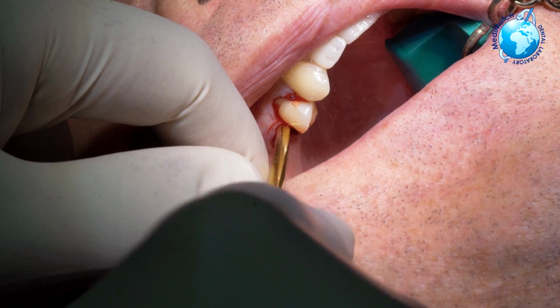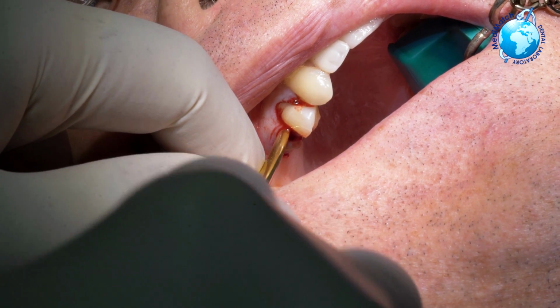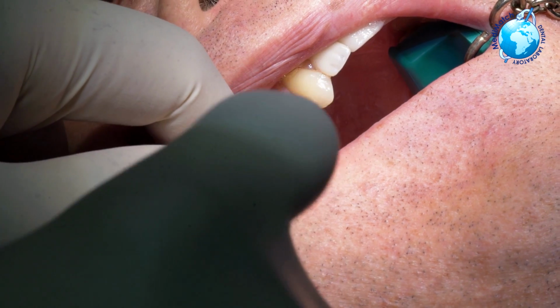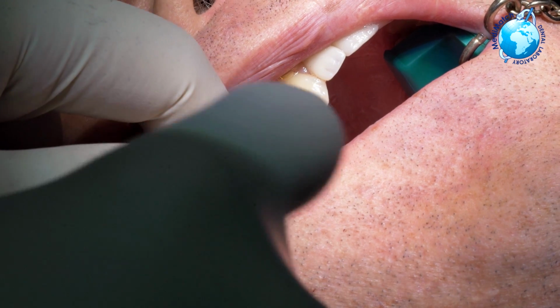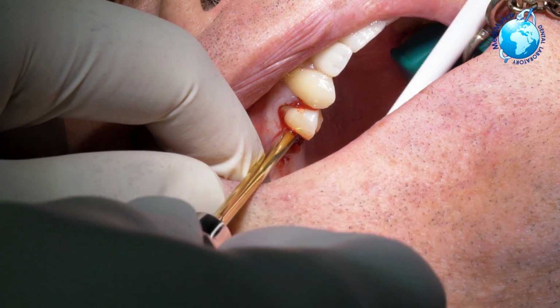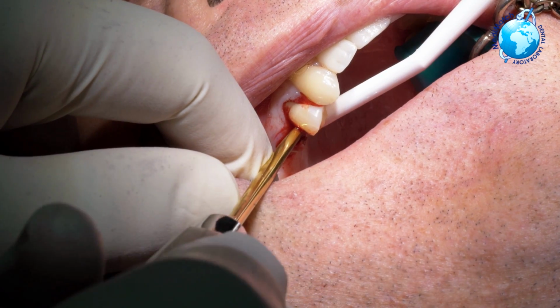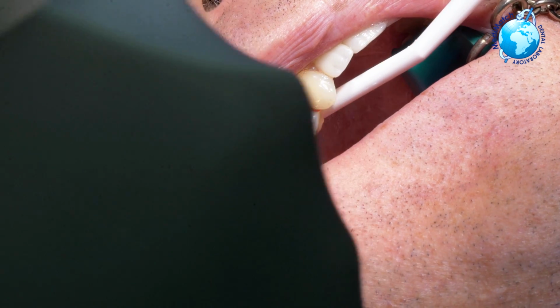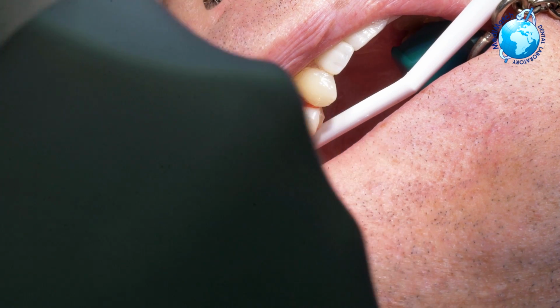And the way we do extractions now is by time and patience, because when you place pressure on a tooth, the PDL will actually release hyaluronic acid, and that acid will actually help release the tooth. It's very important when you're doing implants that you extract the teeth without damaging the surrounding bone of the socket. So we want to preserve that valuable alveolar bone, because once that alveolar bone goes, it never comes back, right? So we can already see we're getting a little bit of movement.